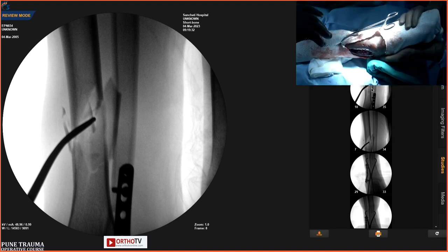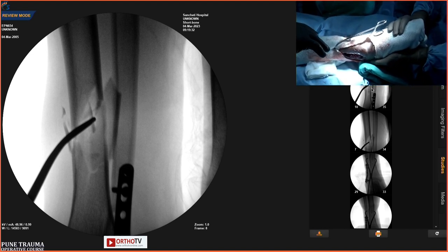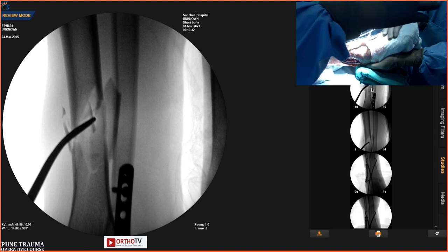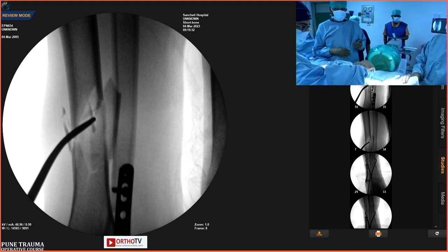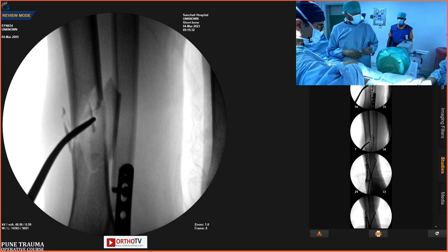Ready? Knife. What number nail? Number 10. Milind sir, 10, 35. I would do the CT for this fracture before taking him into the theater. It is a must rather.